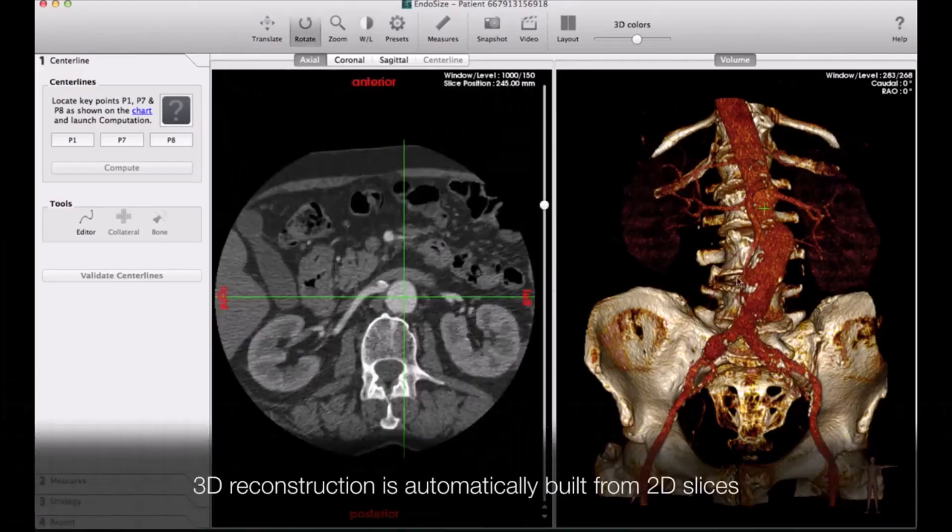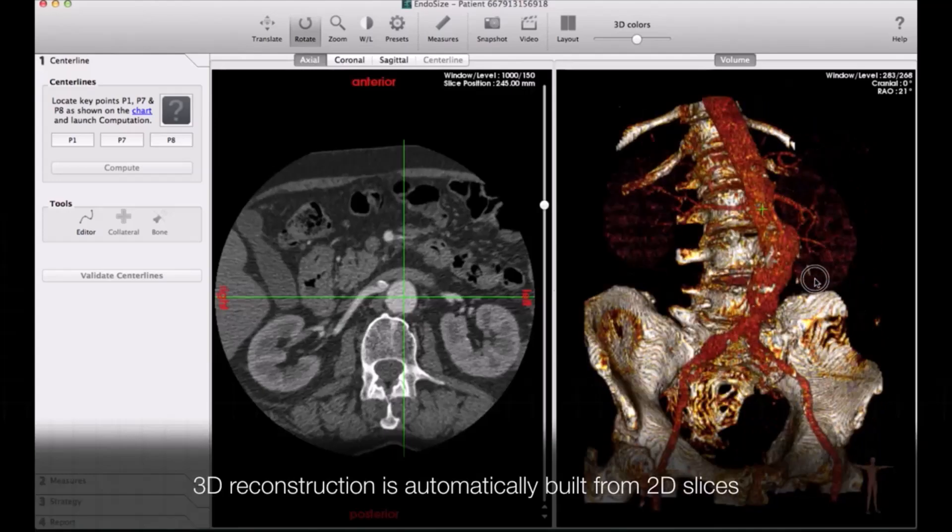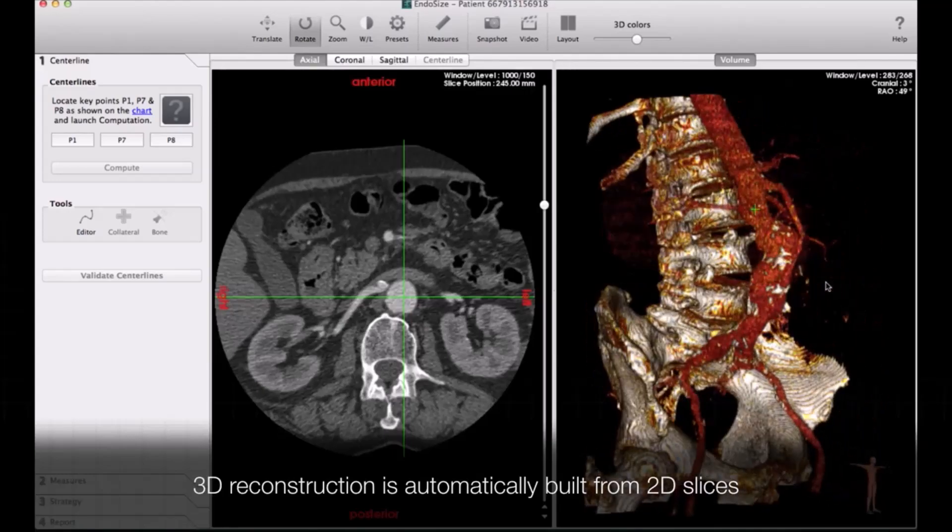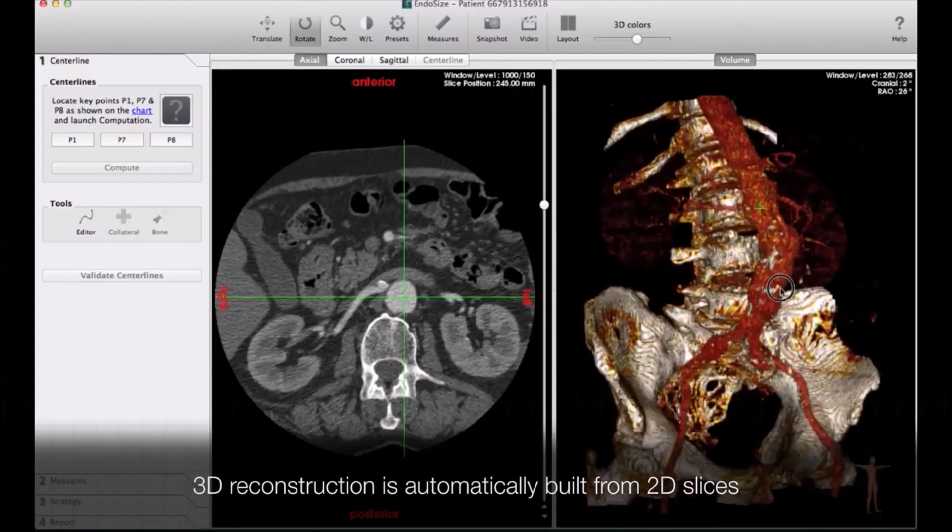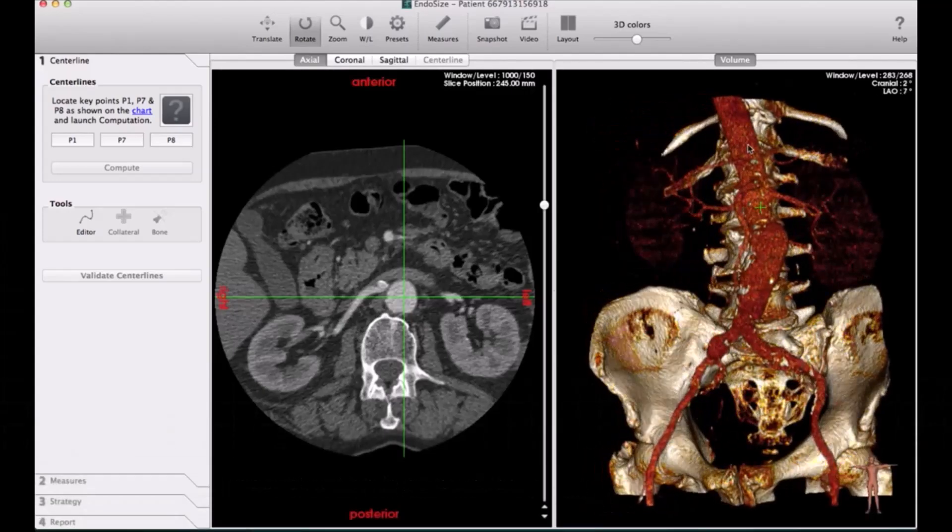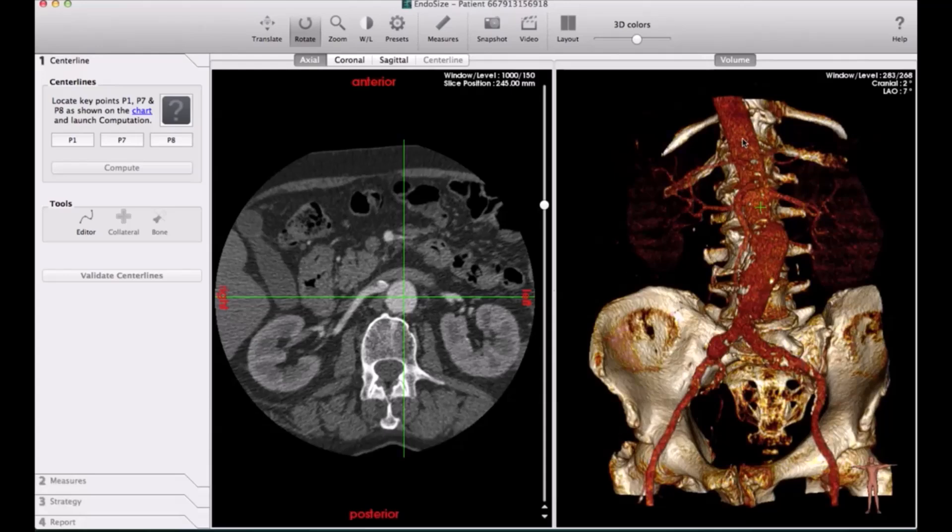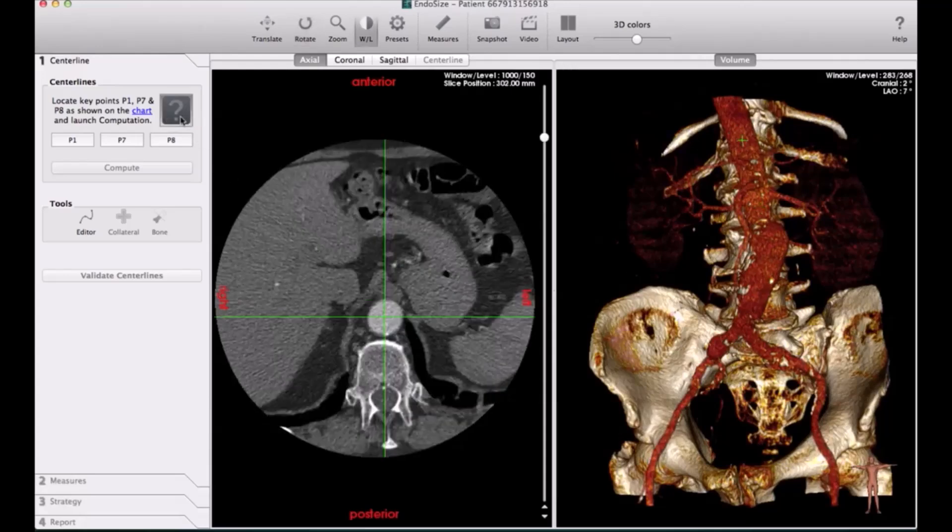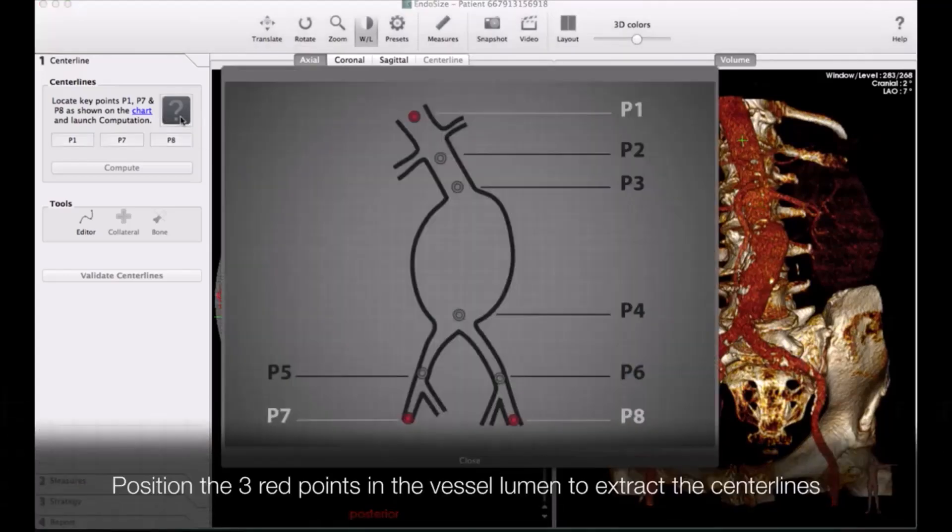Then you select P7 and P8 at the femoral artery. These are the only three points that you need to put. And then the machine.